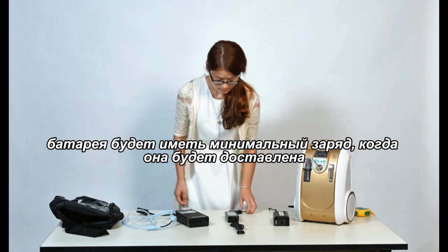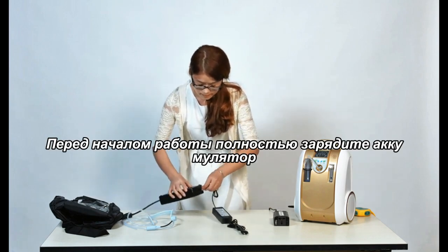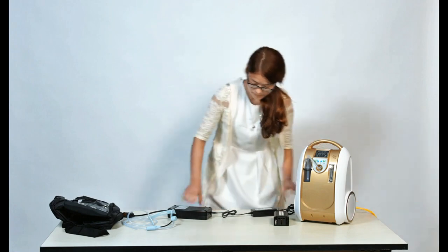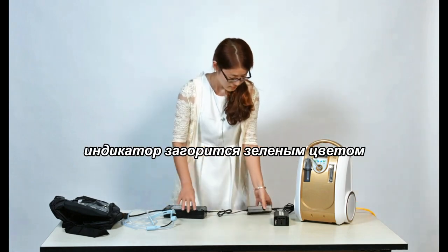The battery will have a minimal charge when it arrives. Please charge completely before operation. If the battery is charged completely, the indicator light will be green.